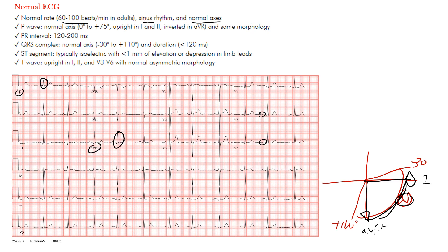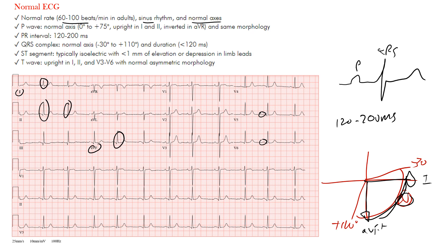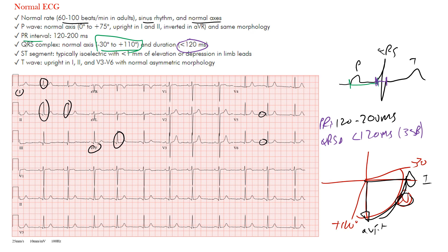I just want to touch on what is a normal ECG. Normal axis here — it's upright in lead two as well. Notice that you have normal PR intervals: the normal PR interval is between 120 and 200 milliseconds, and that's certainly normal here. The PR interval goes from the beginning of the P wave up until the QRS complex. The QRS complex axis we said is within the normal range, and the duration of the QRS complex is less than 120 milliseconds. Remember, 120 milliseconds is three of the small boxes.